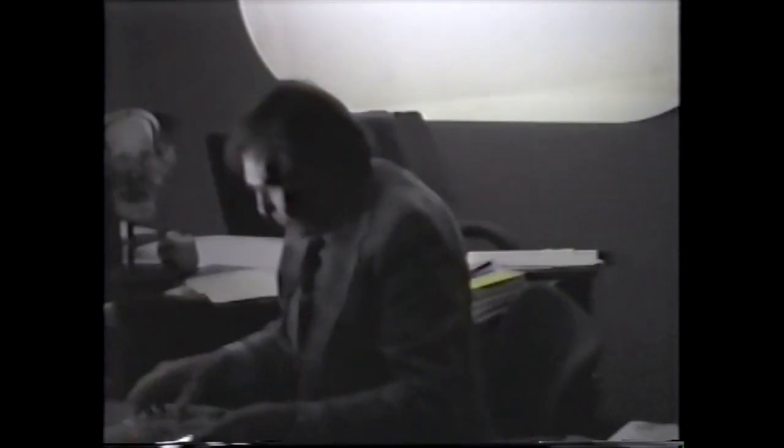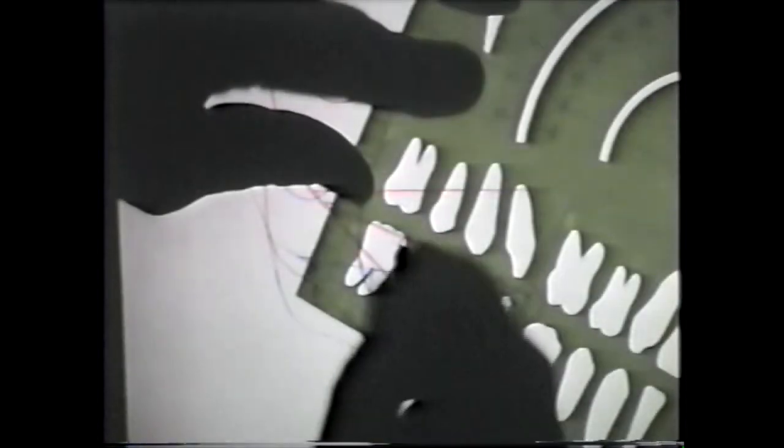I should put the second and third molar in here. We can predict here, for instance, just let me do it for you, right here. Here is what I would forecast. Just like I would forecast, this is what would come out. This is about 11 millimeters wide. So we would do something like this, to predict where a second molar would be.